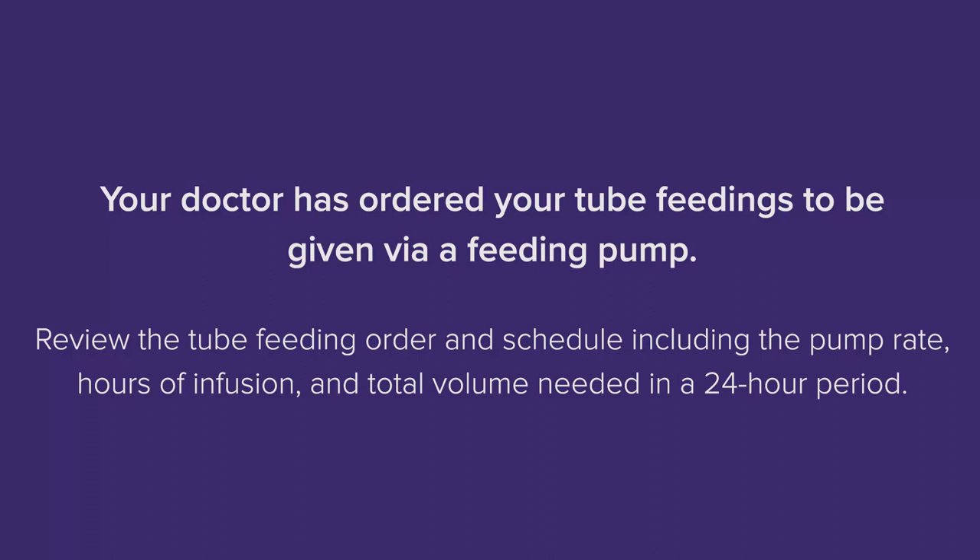Your doctor has ordered your tube feedings to be given via a feeding pump. Review the tube feeding order and schedule, including the pump rate, hours of infusion, and total volume needed in a 24-hour period.